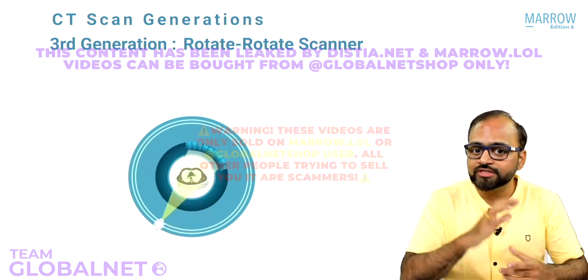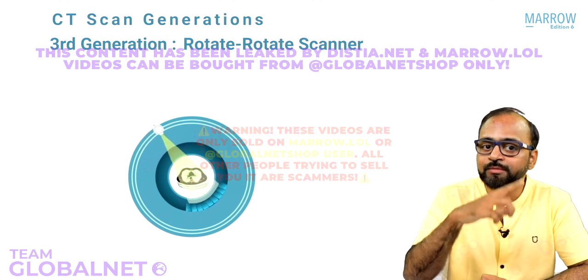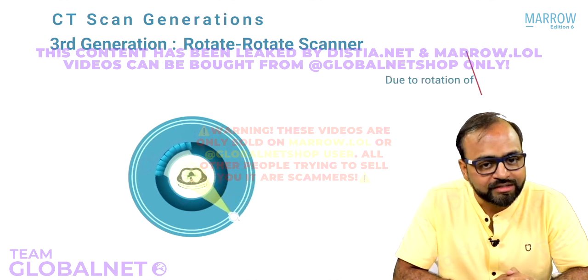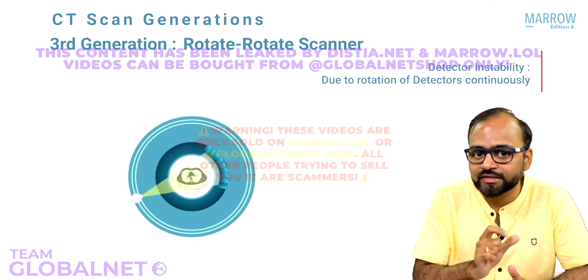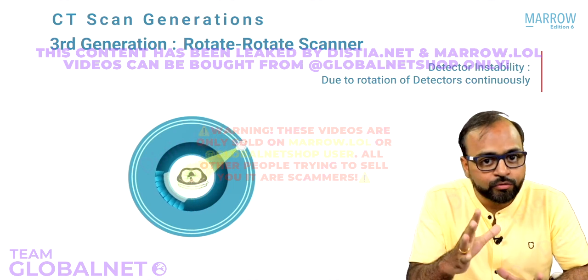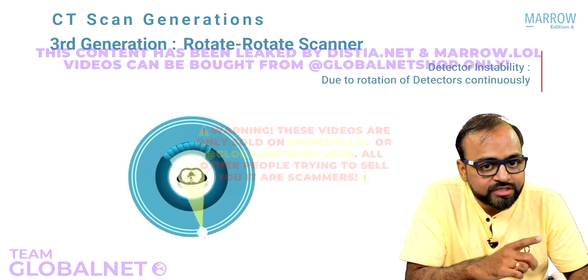So there are two structures which are rotating. One is the X-ray tube, the other is the detector, to get n number of projections, and therefore it is called rotate-rotate scanner. The problem with rotate-rotate scanner is that the detectors, which are electronic detectors, are very delicate structures. So if you rotate them round and round, they will malfunction. You'll have to replace them. Therefore, detector instability was a significant problem with third generation scanners.